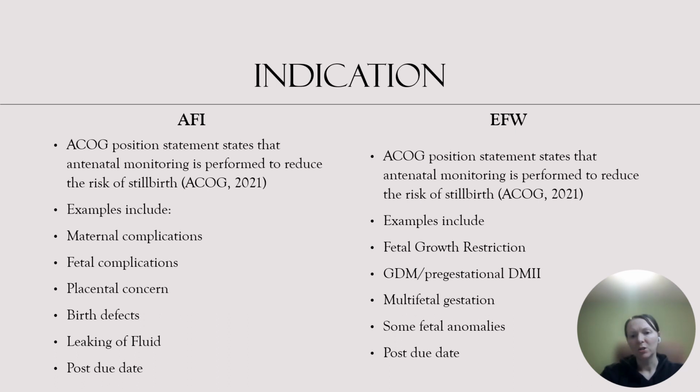If there's a trauma, we may want to do an AFI just to make sure that there's not any type of leaking of fluid. And then for the fetus, if there are different anomalies, that might indicate that we need to do AFIs, depending on what it is. If the baby has hydronephrosis or anything to do with their kidneys, very likely we'll want to do AFIs because the baby's urine output is going into the fluid. If there's something wrong with the baby's kidneys, they might not be putting out enough, or they might be putting out too much. So if there are any baby kidney issues, we'll want to be watching AFI.